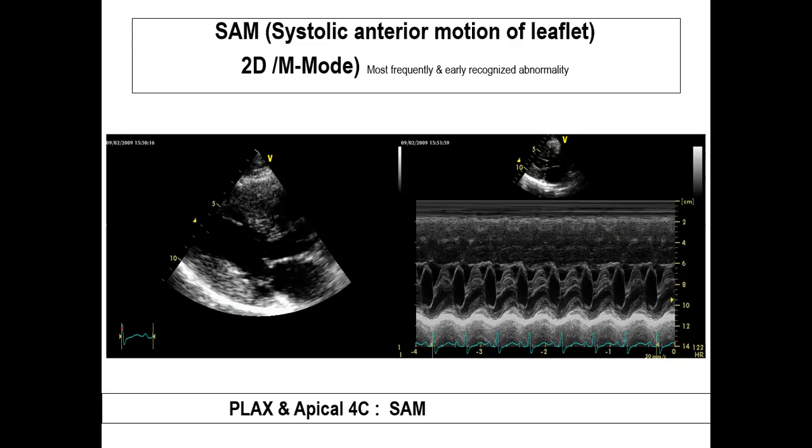AML will go towards septum, what will happen to mitral flow? This valve goes to this. So the mitral valve remains open during systole. It's not early systole, it's mid-systole when the mitral valve remains open and a lot of blood gushes back into the LA through that open valve, because this AML is being sucked into the LVOT. If you don't see MR, then you go back and see again whether there is a SAM or there is no SAM. Clear? Yes, sir. All right.